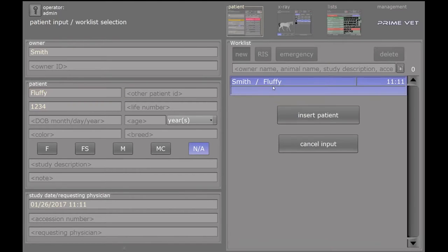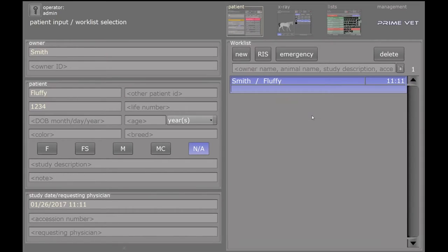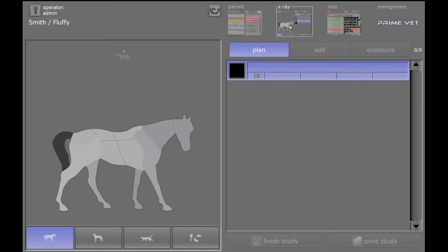And then we'll select Fluffy and insert it. And then now, Fluffy's selected, we can go to X-ray.